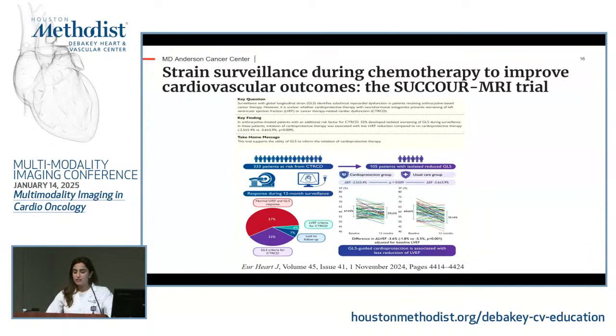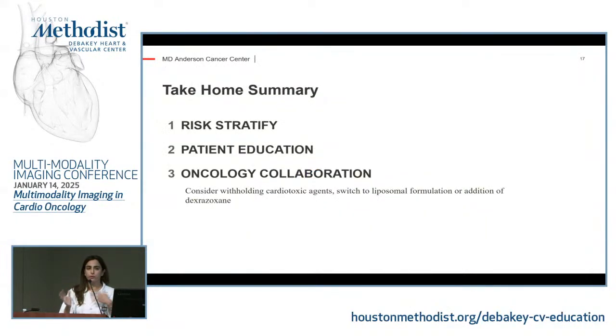So it's quite a complicated story, and you might hear it in my voice, like there's a little bit of hesitation. We in the cardio-oncology community at this point understand that the cardiomyopathy and strain abnormalities precede LVEF changes. However, what do we do clinically about this is a big question mark for us.